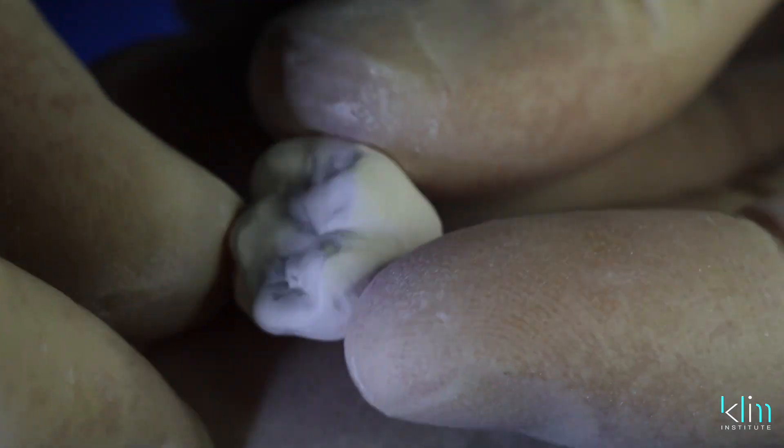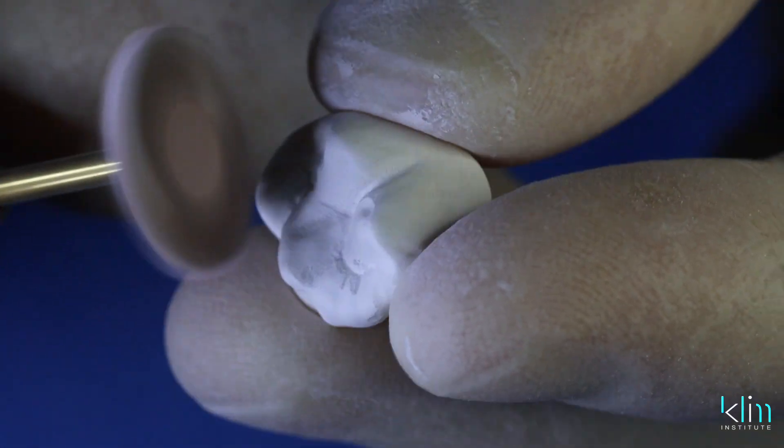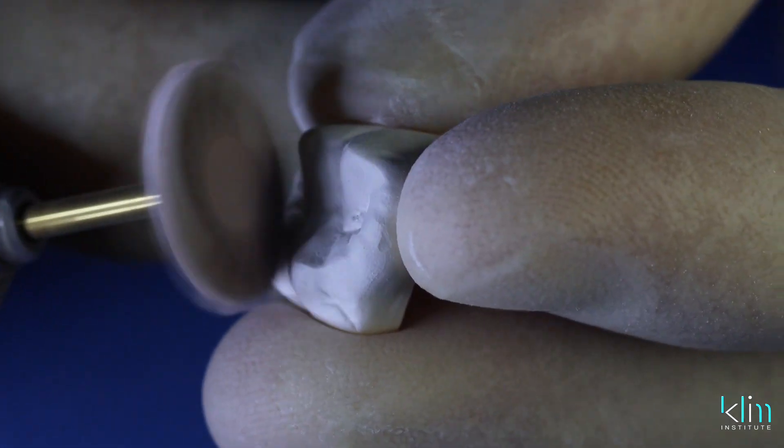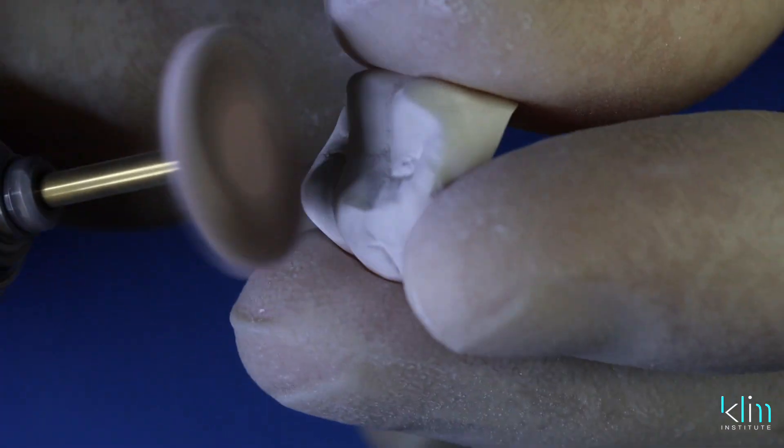On the occlusal table, use the side of the twist polisher and it will effectively polish the triangular ridges and the convex surfaces.